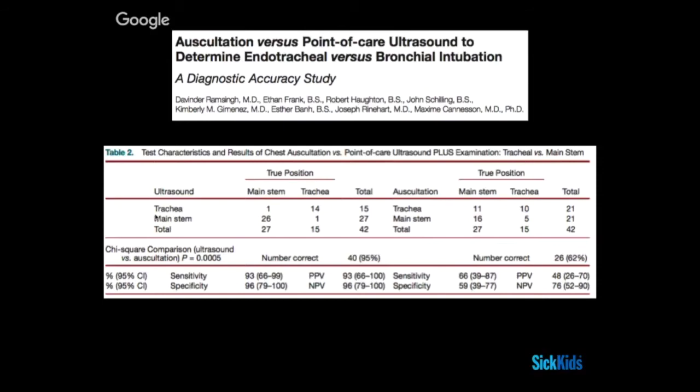Yeah. So that would be their way of saying it, because if it's in the mainstem, you presume that your dilatation is going to happen somewhere in the mainstem, and you're not going to see it up there. It's not clear how true that is in kids, whether you might still get some dilatation. And of course, in kids, you're talking about a much smaller area that you have to be precise within. So joining the two things together, no lung sliding on the left with no tracheal dilatation, the chances are that the tube is probably low.